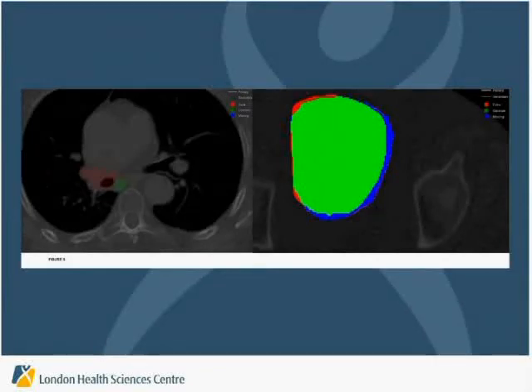So getting back to a couple of those areas, this is the example of the undercontoured bladder that we were able to show you or to detect, and this was an example of an overcontoured nodal contour that the QA2 system picked up.